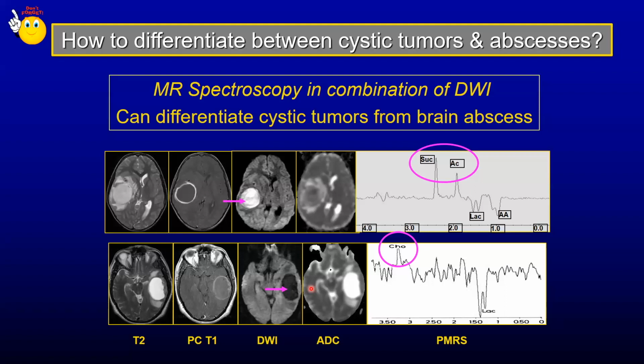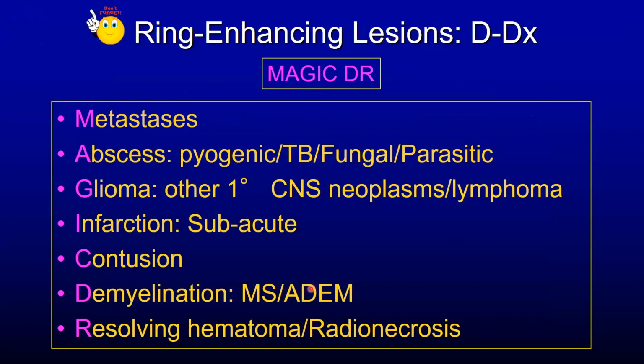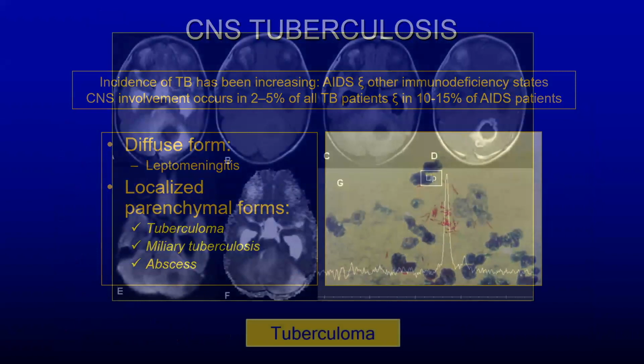So I don't know if you've had experience with this, but what I like to do is, on PACS, I reverse the contrast on the T2 weighted scan. I link the images, with the theory that every sulcus I see on the T2 reversal image that is dark, I should see on the FLAIR scan. And whenever I see a mismatch in those two, and oftentimes it's subtle, it can be in the occipital region, can be in the subfrontal region, I usually will say that's abnormal. And you can see that finding in some patients before the enhanced scan is abnormal. The other trap, coming back to your point of why we're not the primary diagnostic tool, is that until the protein gets to about 100, the FLAIR scan can still be normal. Anyway, I just wanted to mention that because I found it to be helpful in my practice.